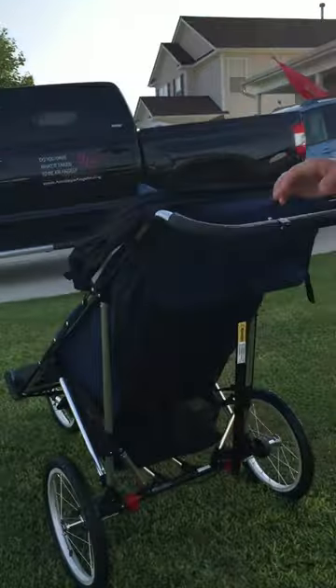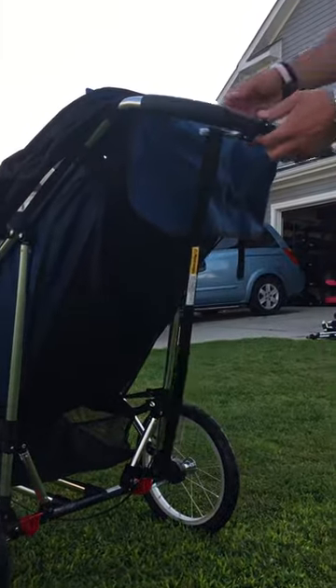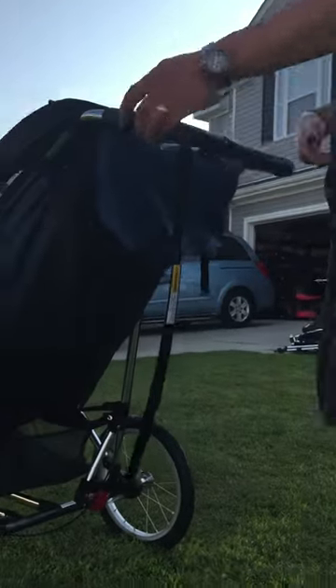First thing you want to do is make sure that your brakes are up in the upright position and unlocked, and then secondly you want to come to this handbrake and make sure it's unlocked. Easy day.